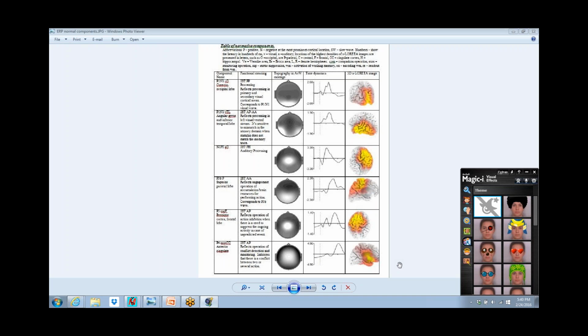Let's say I have perfectly wonderful alpha at the back of my head at 10 hertz, a nice normal pattern at the back, nothing excess up front, nice coherent pattern at the back. And you could reach into my thalamus and change the polarization and slow it down to 6 hertz. And you could do that. I mean, thalamuses can go below 6, so 6, 7, really easy. The databases will tell you it's too big when it's just at 7 instead of 10.